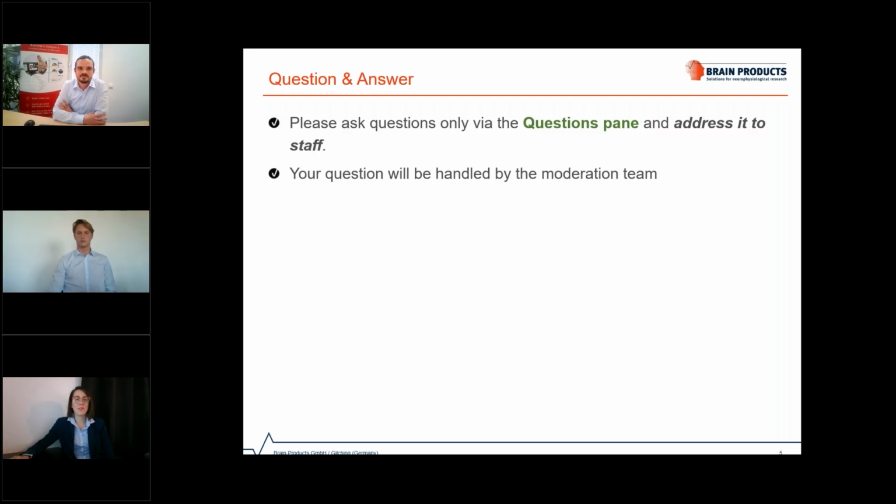Okay, thank you for the really informative answer. I also have another question about solutions in Analyzer. If we have an automatic sleep scoring solution. No. In short, we don't have an automatic solution for scoring or for the detection of sleep features.